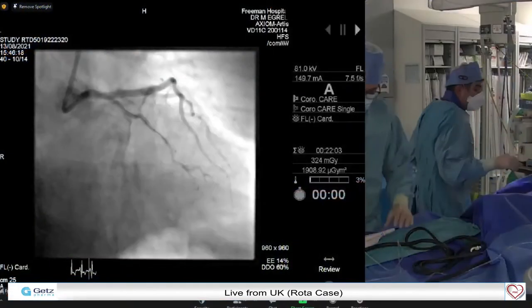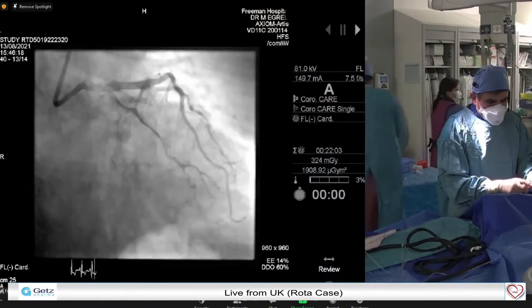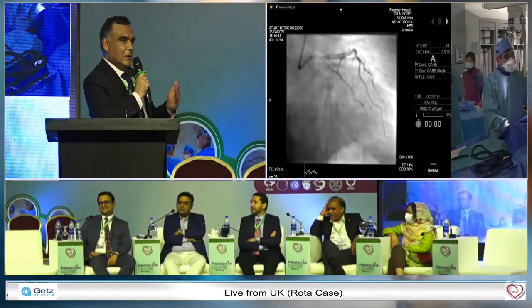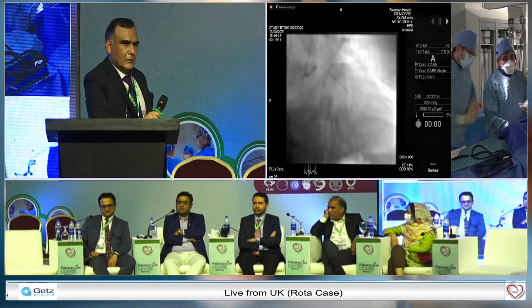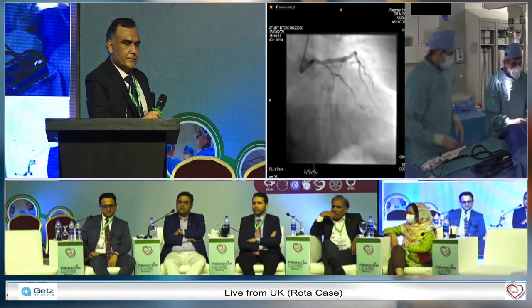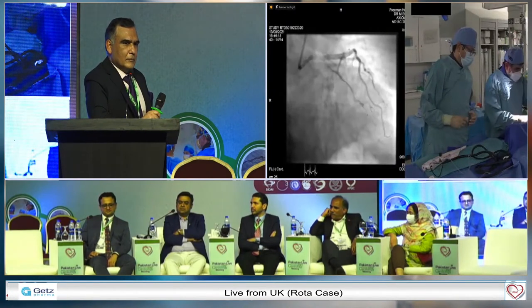I know there have been 2 or 3 cases now where people have used the guide liner. So you take that 7 French going distally. Even for this, you could leave your wire in the side branch, but I think it's quite cumbersome. What you mentioned is absolutely valid and can be done. And I have done it on a few occasions where I didn't want to take my side wire out. If you do it with a small burr, it doesn't affect.